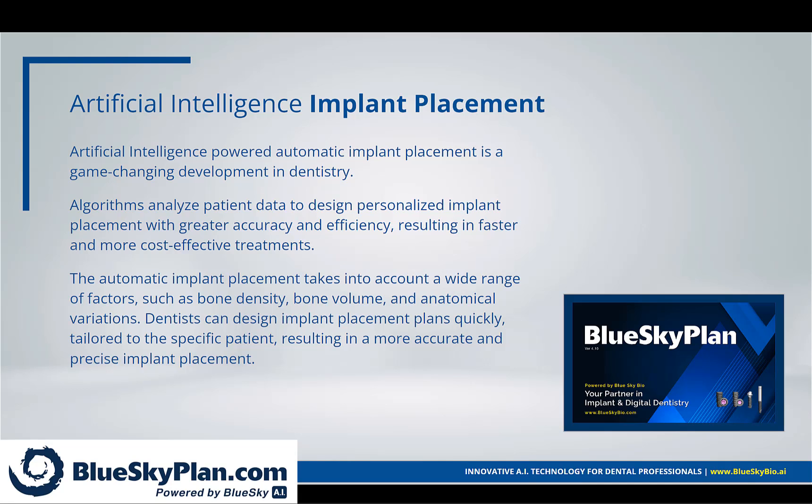The automatic implant placement takes into account a wide range of factors such as bone density, bone volume, and anatomical variations. Dentists can design implant placement plans quickly, tailored to the specific patient, resulting in more accurate and precise implant placement.